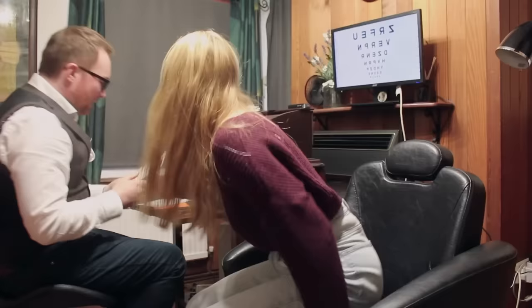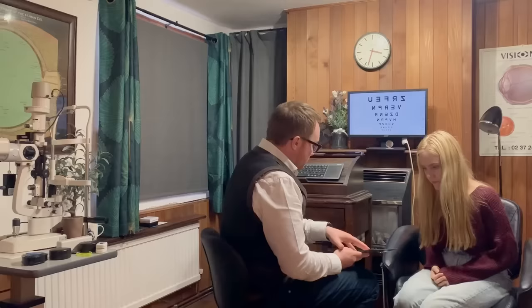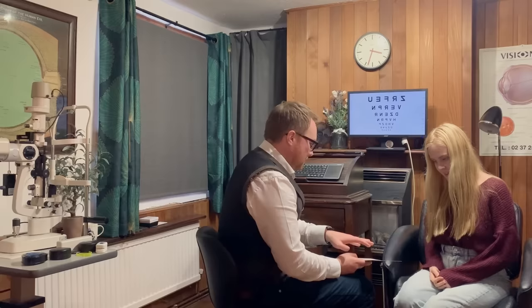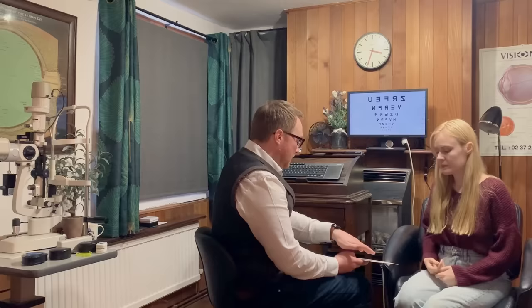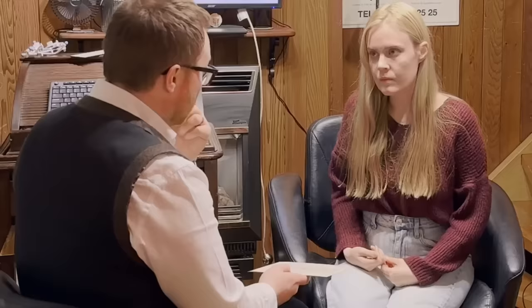So this is a copy of your prescription. This is the bit that you would take to an optician. They'd be able to sort you out with some new glasses. As I say, there's a little bit of short-sightedness in both eyes, a tiny bit of astigmatism, but nothing to worry about. I've put you down for a year review, and that's really just so you can re-photograph that little freckle. Not that I have any major concerns over your vision, because this is largely the same as the glasses you got 2.5 years ago, so I'd be quite comfortable saying your short-sightedness seems quite stable. I don't think it's changing a huge amount, which is good.